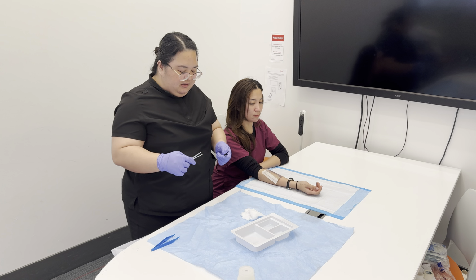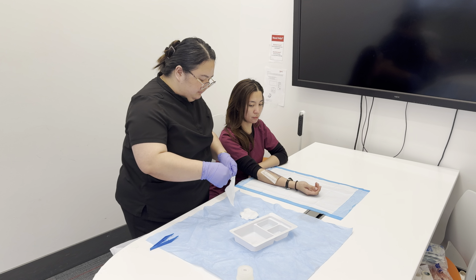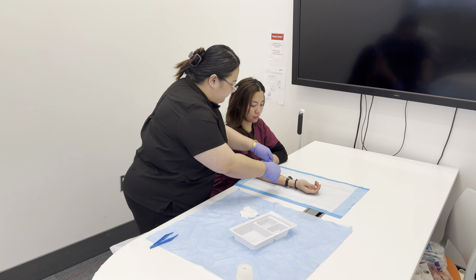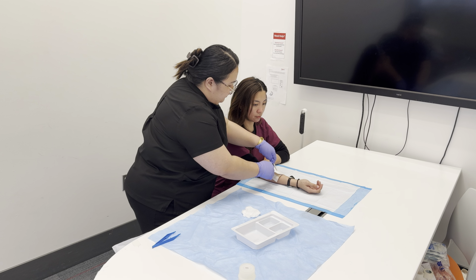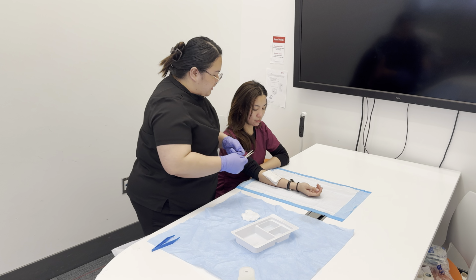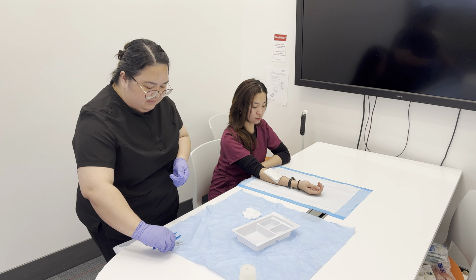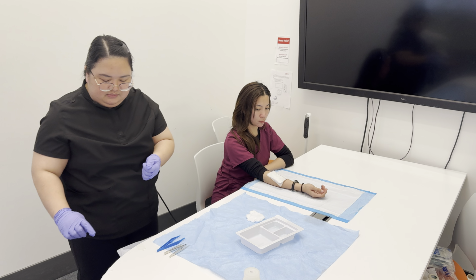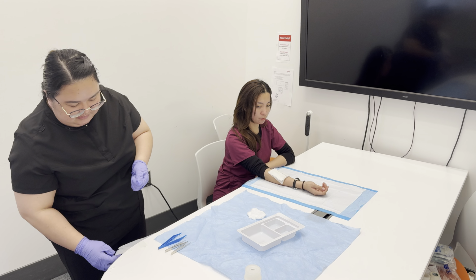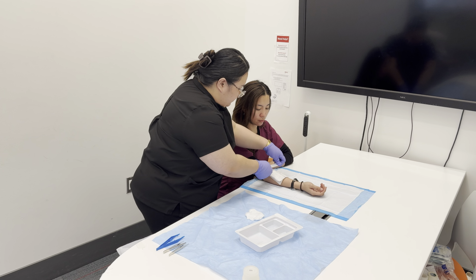And once you're done, put on the 4x4 gauze and make sure to cover the wound to prevent infection. And put the forceps beside, and then tape it on all 4 sides.